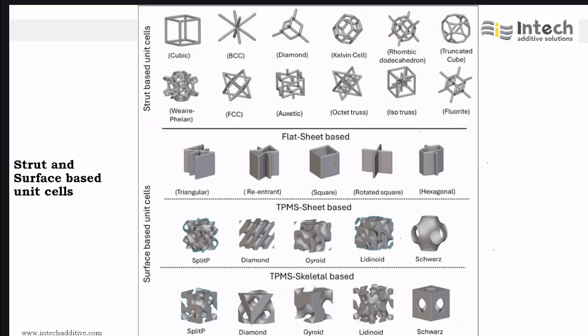Maybe you have installed it in a different directory. Then you will go to Python home. Inside Python home, there is a library directory, and inside this there is something called site-packages. In the skeletal TPMS variant, you can see it has the same geometries but different connectivities, maximum areas for cell attachments, continuous, no sharp stress concentrations.